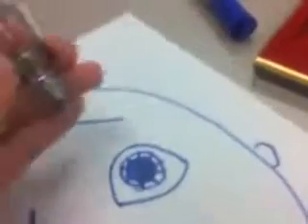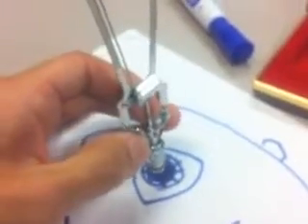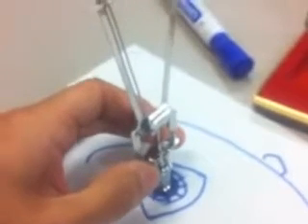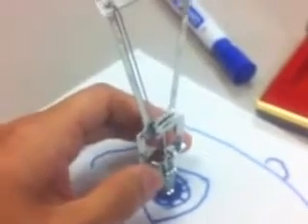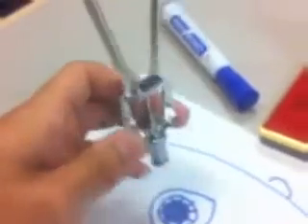So what we would do is we would take our patient and we would take this weight off his face, and we would have his anesthetized eye, gently place the tonometer over the patient's eye, holding the sides of it with the thumb and forefinger, and we would rest it then on the patient's cornea, the center part of the patient's cornea, and then we would take a reading.